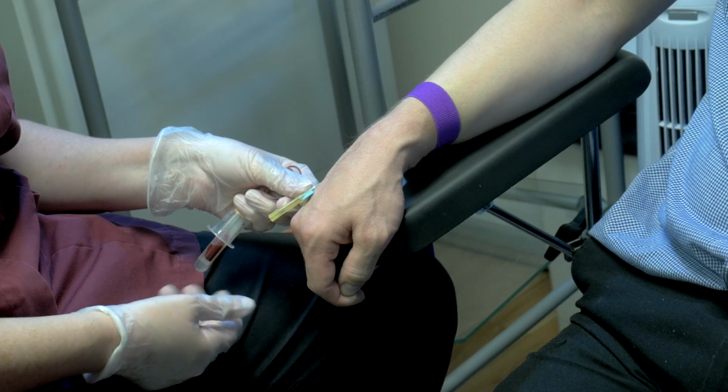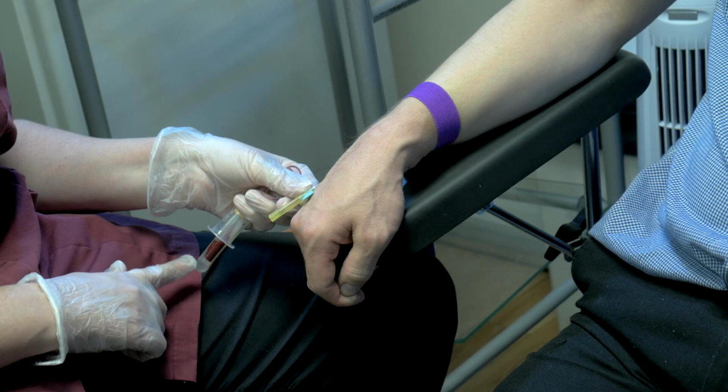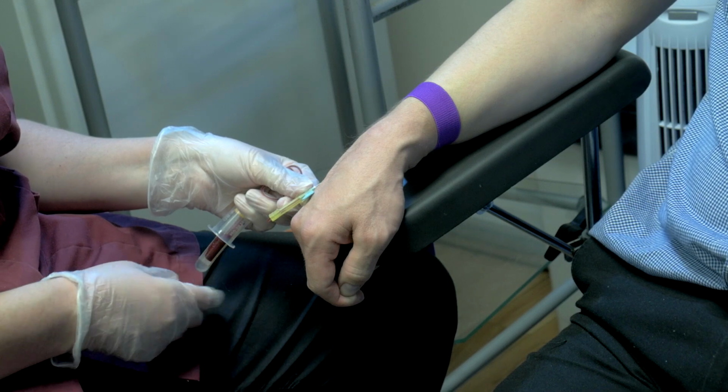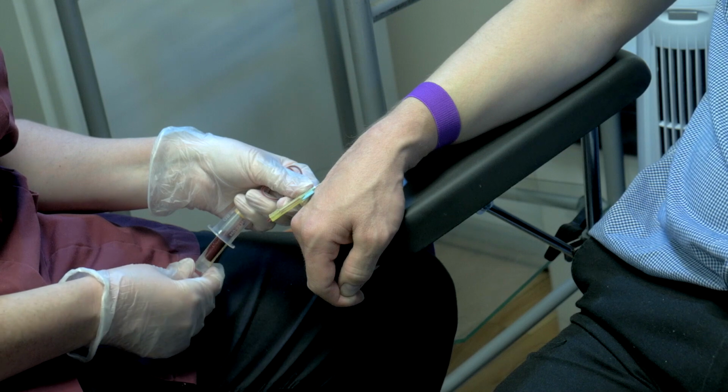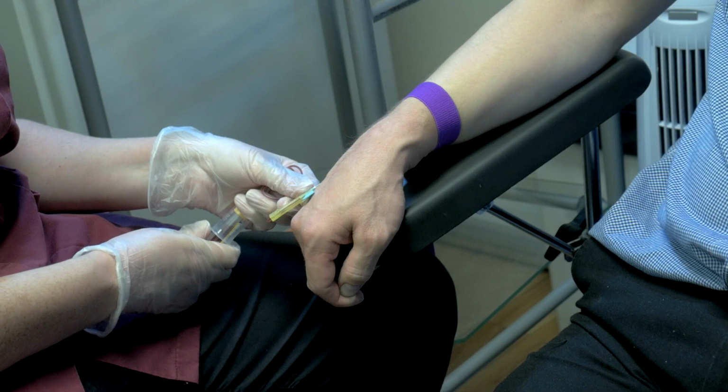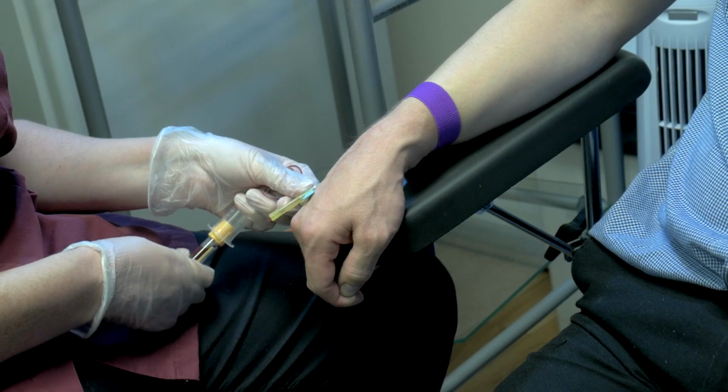These always look like they're slightly underfilled because we have all the gel in the bottom here. Don't let that worry you though. As soon as it stops moving in the tube, it's done. Perfect.